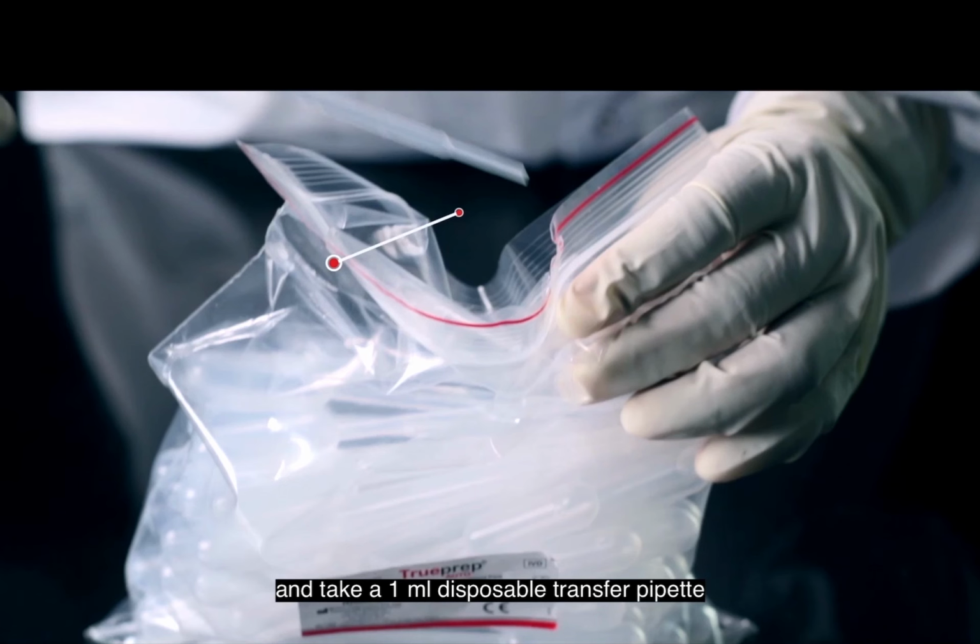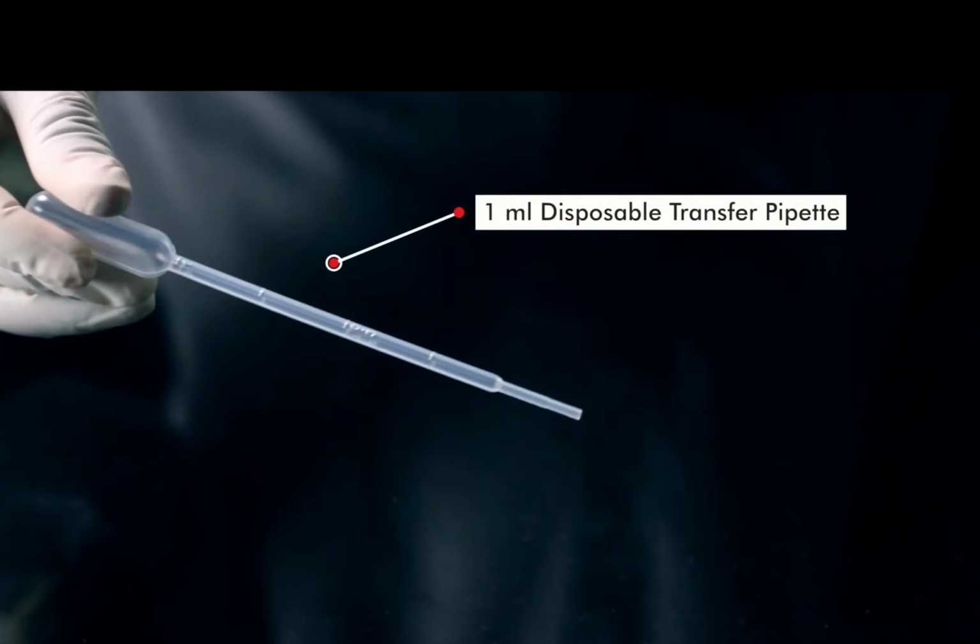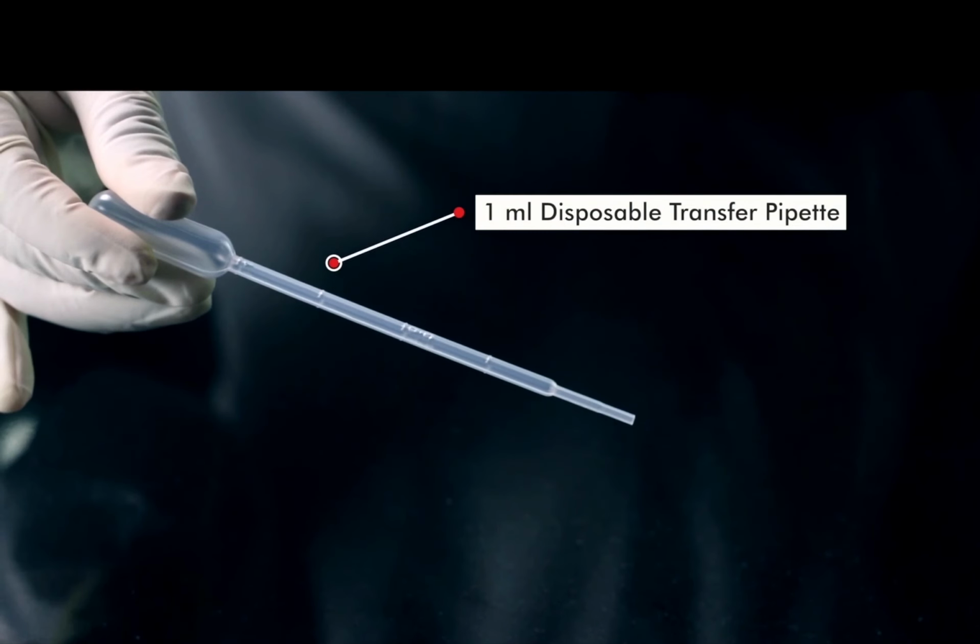So take a 1 ml disposable pipette. Notice how he is taking this pipette. Another important thing: all these pipettes come in a Ziploc bag. You shouldn't put your hand inside this Ziploc bag. You open the Ziploc bag, and with the help of the other hand, slowly nudge a pipette out, and take it with the other hand from outside the Ziploc bag. Please don't put your hand inside the Ziploc bag. There is a risk of contamination and you can get false positive results even with this particular method. So please carefully take the 1 ml disposable pipette.